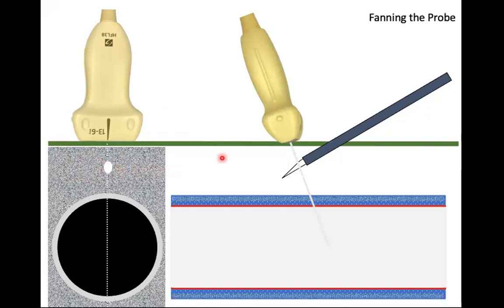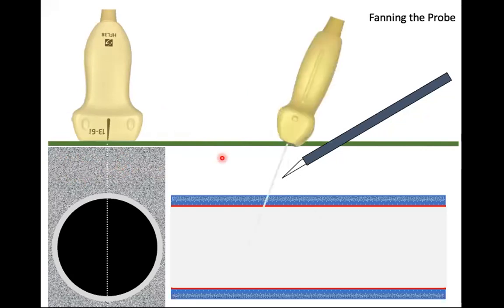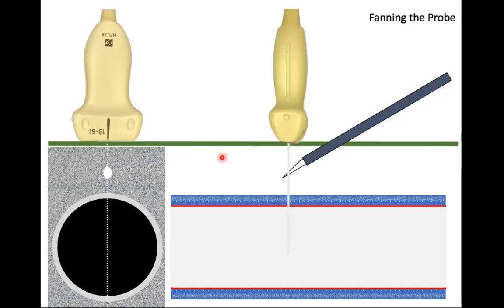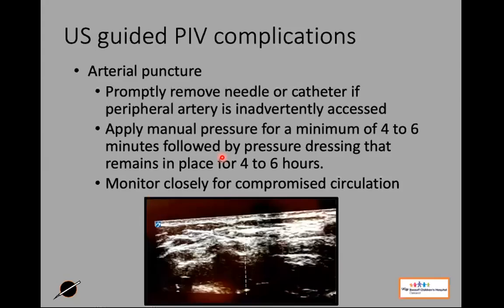Okay, we're further up the catheter, we're looking at the bevel. And if you go the other direction, we're right above our needle tip, but we're not capturing the tip of our catheter here. So I want you to think about this and pay attention to where our probe is, making sure that it's perpendicular to the skin. All right.